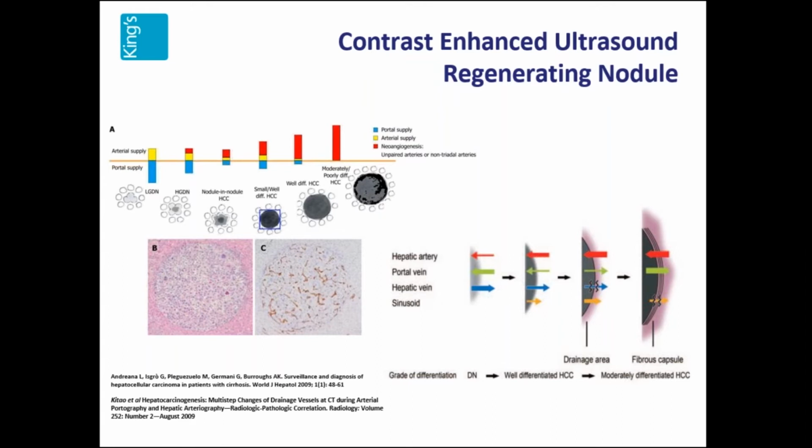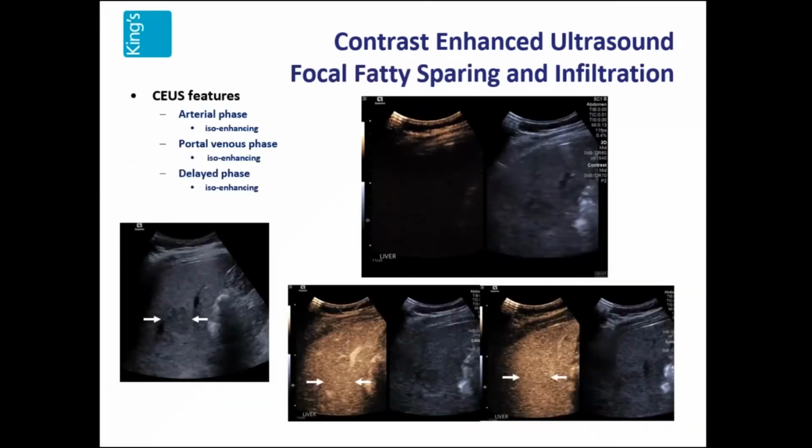But again, the hallmark for the presence of the HCC is the washout, but it may be much later in the course of the examination, maybe 5 minutes after the injection.